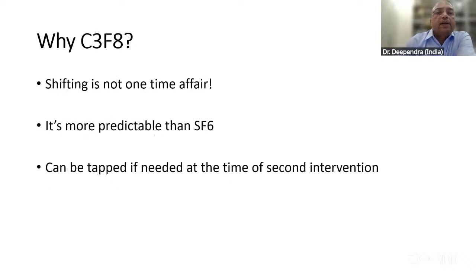I have already highlighted that shifting is not a one-time affair. It keeps shifting, and if there is a large amount of blood, I think longer acting gas works very well. If you have a one-eyed patient who is disturbed by that bubble, anyway you are going to inject anti-VEGF after a week or 10 days. So in that scenario, you can always tap it if you need to get rid of gas. If it has done its job, you can tap it.